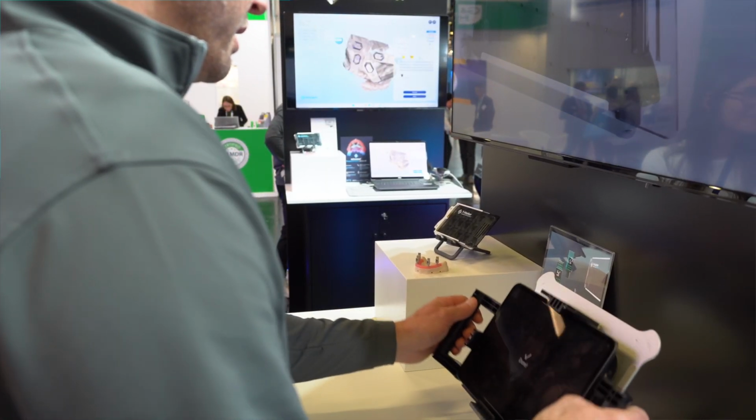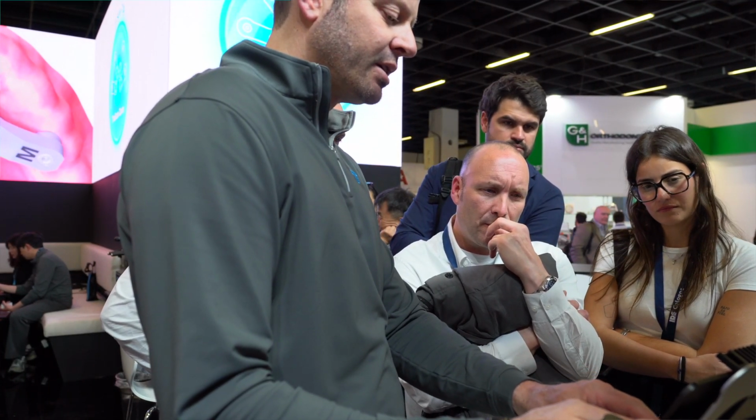The problem, well, maybe one of the hurdles, should I say, with photogrammetry is the cost of it. So the idea that we came out with was to use a more applicable technology that we already have, using the iPad with the actual locators or the markers themselves. So it can save some money, obviously, and it also utilizes some technologies that we already have inside the office.